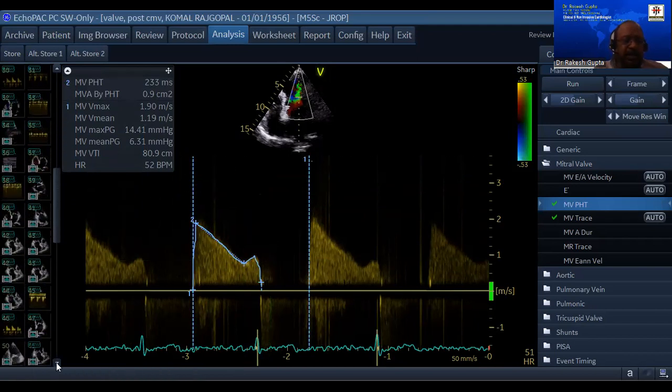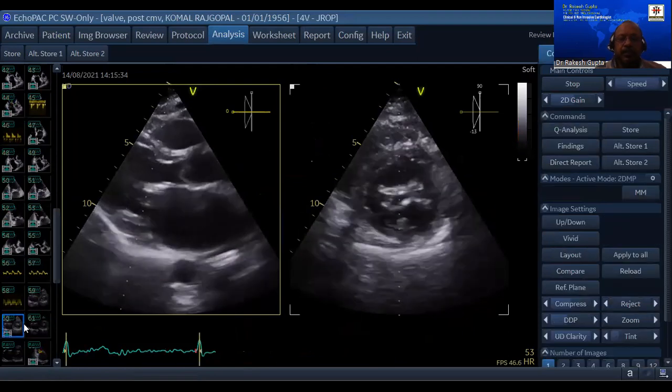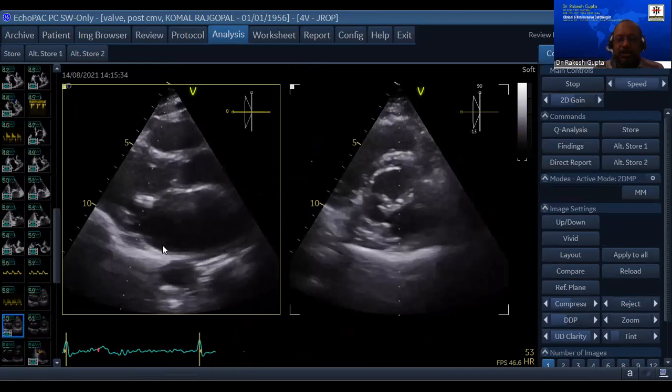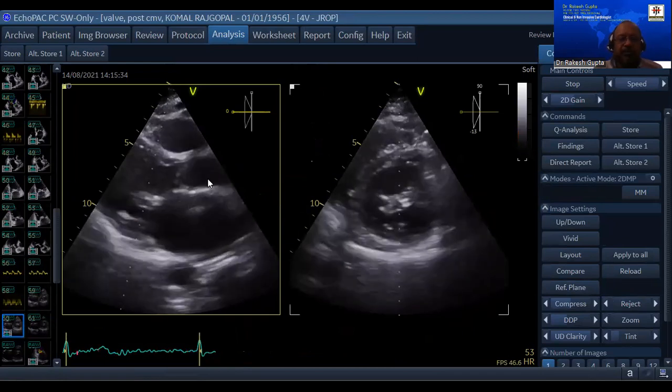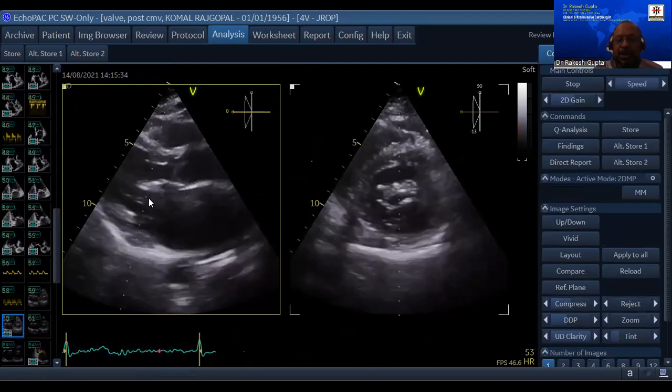Let's look at the mitral area by planimeter. Look, this is what I was saying. Again, a picture which I was trying to show you. Now we are seeing a 2-dimensional picture in one go. Right now, I'm at the tip of the mitral valve leaflet.